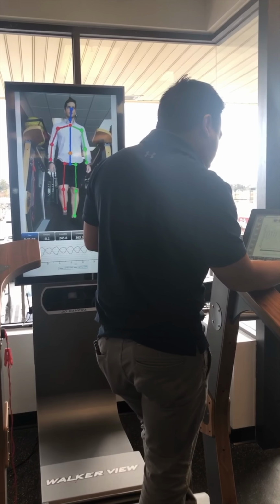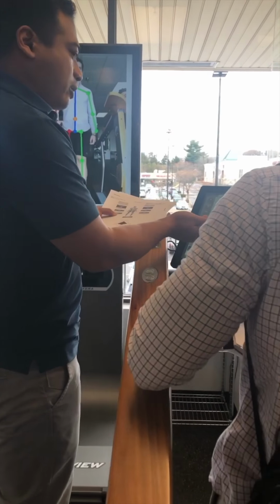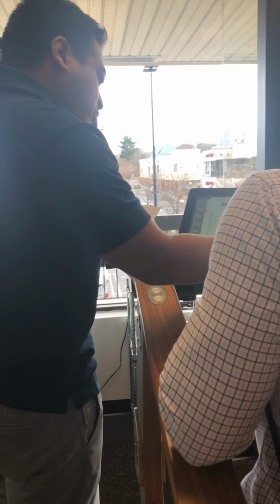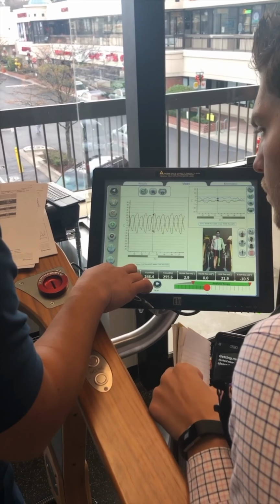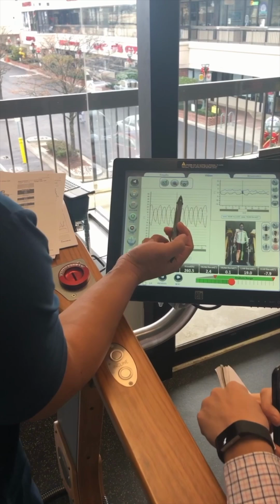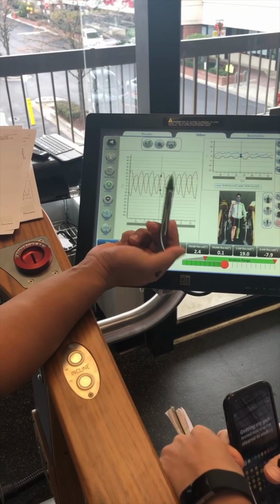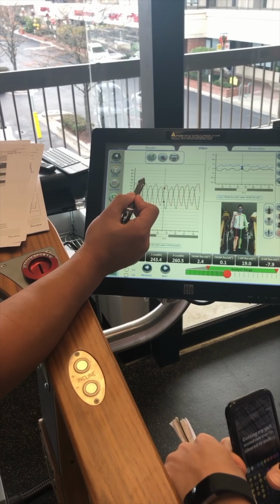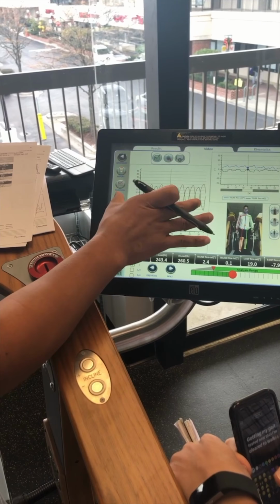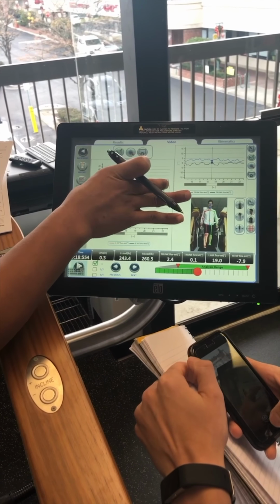So if you come look at this here, the red and the green here are your two different hips, right? So if you look at this trend, you can see higher amplitude. Right, so you can see that generally speaking, all these peaks down here, obviously we want symmetrical hips, right? So you can see that these green peaks sit lower than these red peaks, right? So your left hip is compensating by just living in some forward flexion, right?